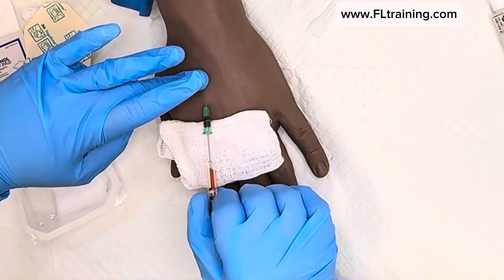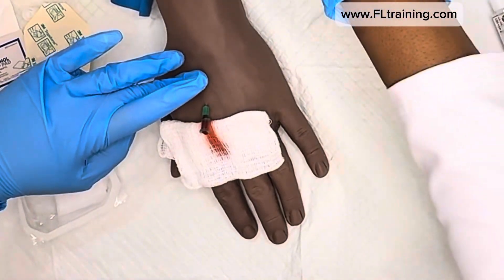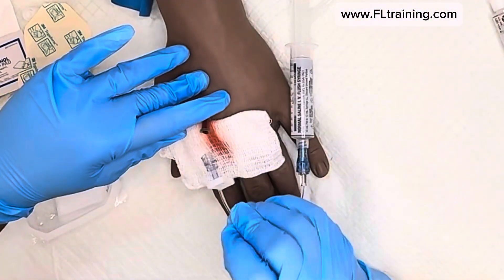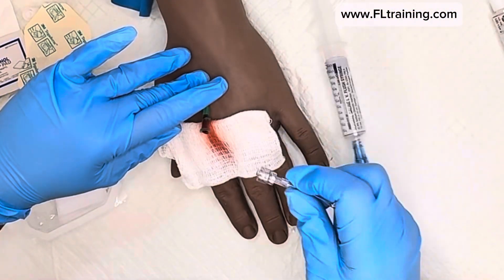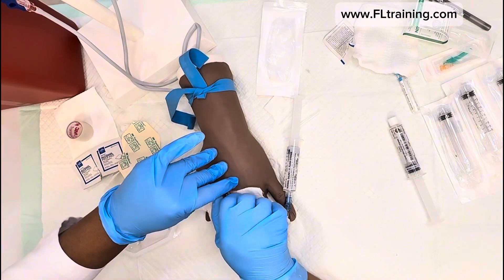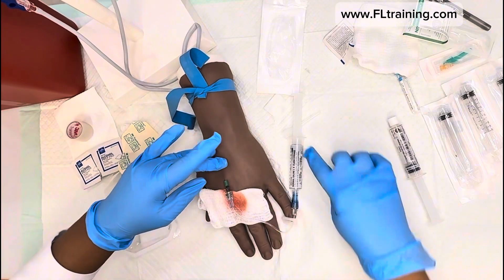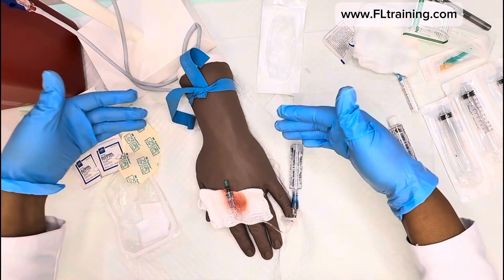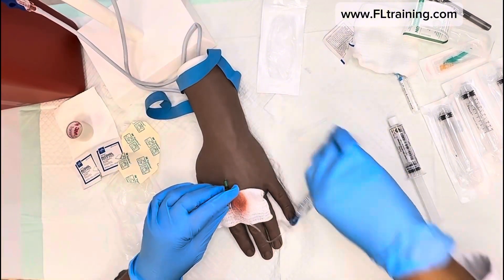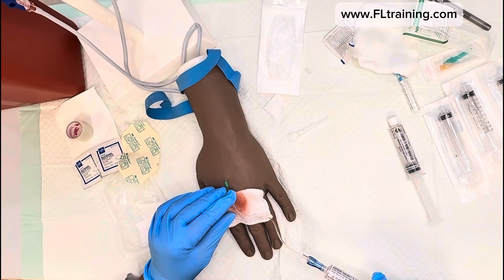I'm going to take that gauze and occlude the vein by pressing on it, then remove the needle and put it in the sharps bin. I'll connect my connection tubing. You don't want to flush while the tourniquet is still in place, so quickly release the tourniquet.